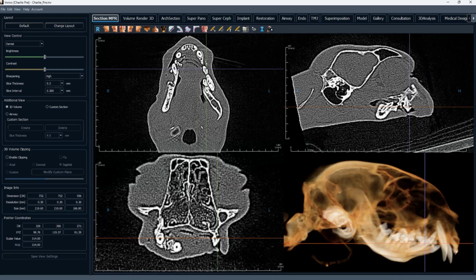But right now it's completely blocked in by the lower mandible. So it's kind of a small fish to fry for this guy, but it's just another reason that we need to do more than just get his jaw open. We probably need to get most of these teeth out.